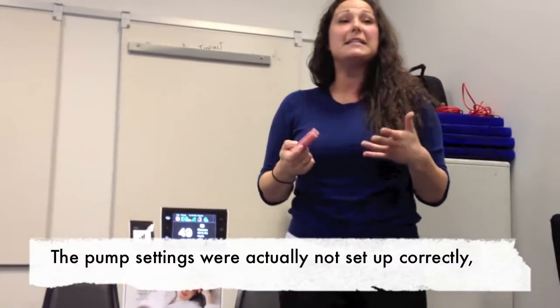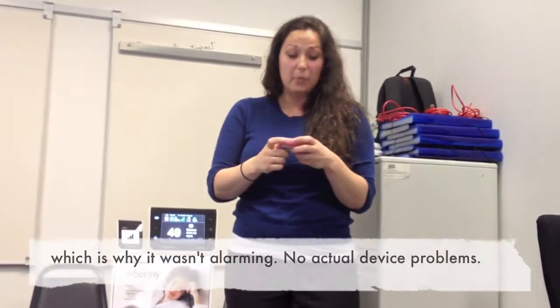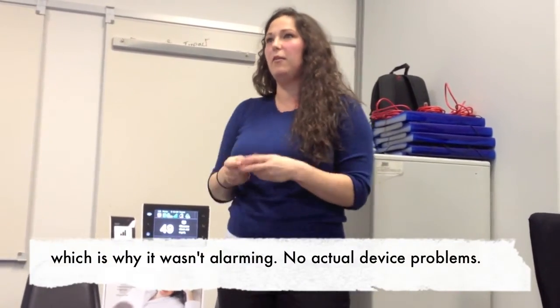But what we can also do, just to show you what an alarm would sound like, is I can set an alarm clock alarm. So similar to on the pump, you can actually, just so I'll show you what it would sound like, we can set an alarm clock so you'll hear what that alarm would sound like.